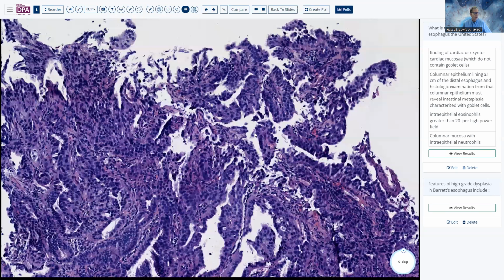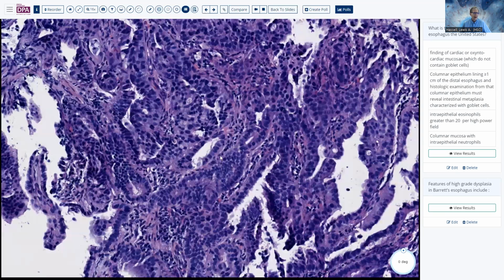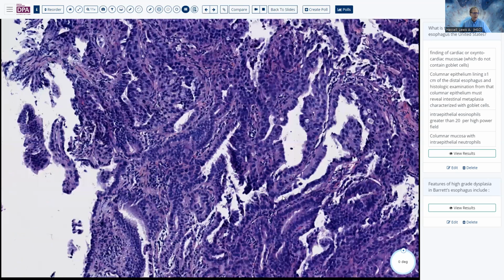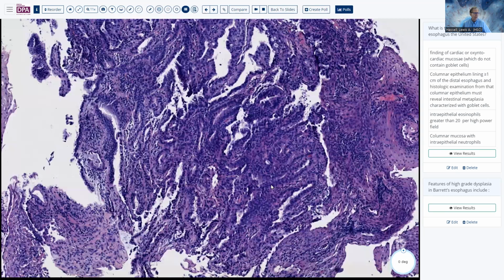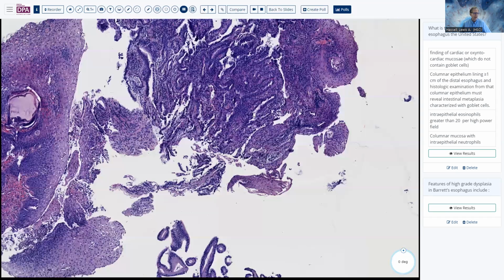But in fact, as we go looking down on this area, we don't see right off any definitive evidence for intestinal metaplasia. A few little vacuolated spaces here that might raise concern. In my practice, we don't generally use the Alcian blue PAS stain, but that can be useful for demonstrating the presence of intestinal type mucus if you need it. However, usually our H&E is sufficient.